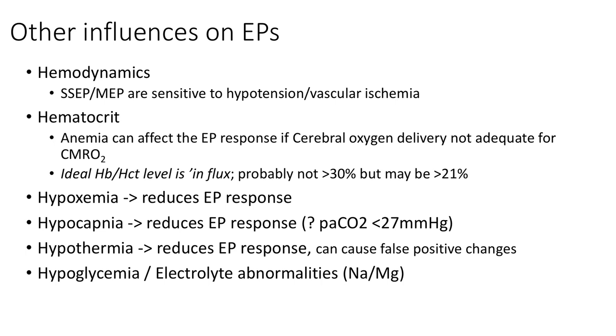If you use SSEP alone, without MEPs, you miss the motor tract, so the sensitivity is probably then less, around 50%. So that's why most of the time in spine surgeries, you combine both monitoring modalities.